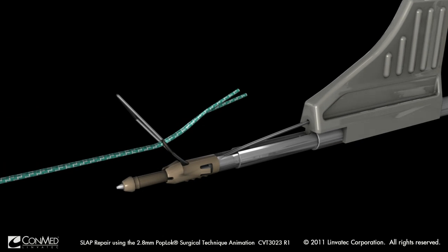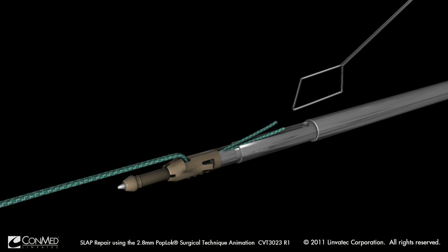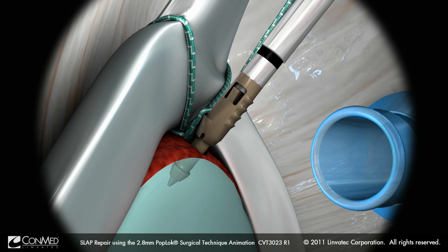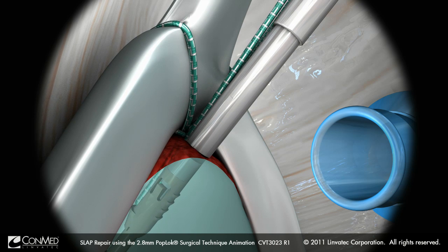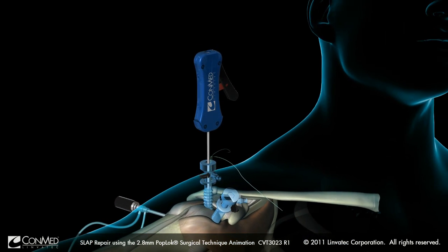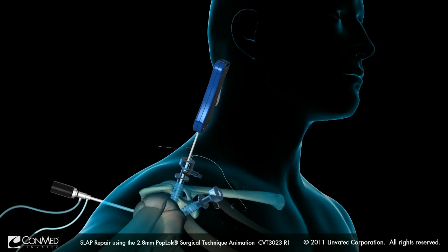Both suture ends are loaded through the 2.8-millimeter pop-lock eyelet, and the anchor is inserted into the pilot hole until the laser line on the driver lies just below the glenoid surface. The driver lever and the eyelet on the anchor are collinear. To ensure that the implant's wings deploy anteriorly and posteriorly, the driver lever must point superiorly or toward the patient's head.